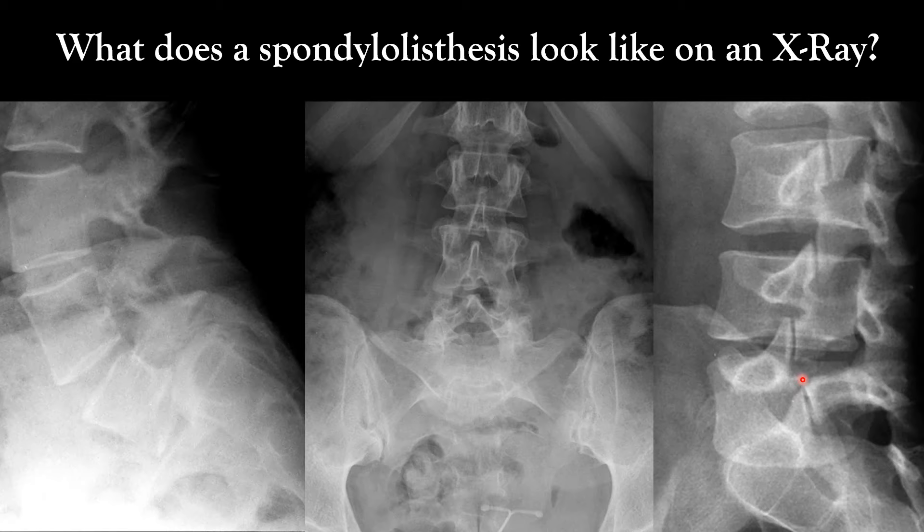On the frontal radiograph — this is L1, 2, 3, 4 and this is L5 — we can see an inverted Napoleon hat sign. We're basically seeing an axial presentation of that L5 vertebral body. This is a good example of what a spondylolisthesis looks like, and we'll break it down and look at all the different pieces of it.